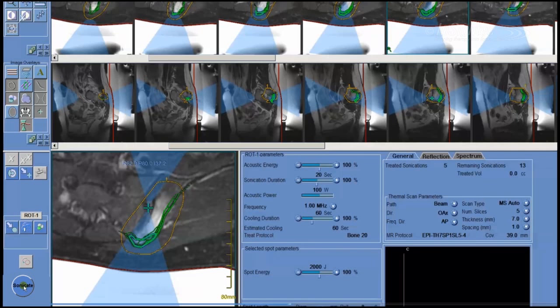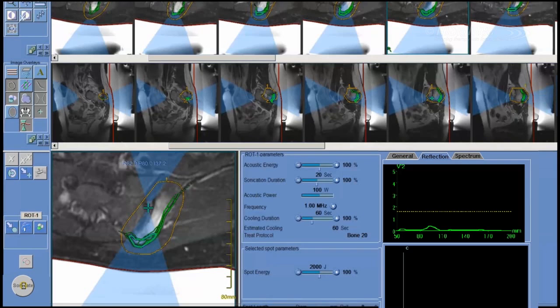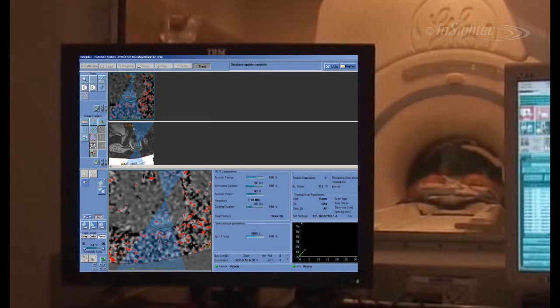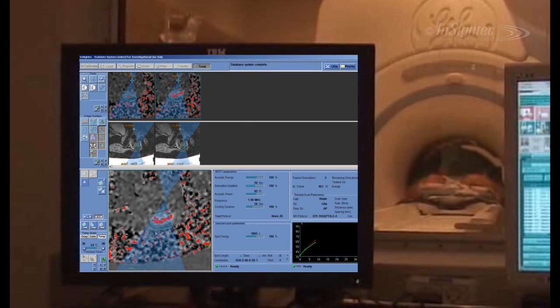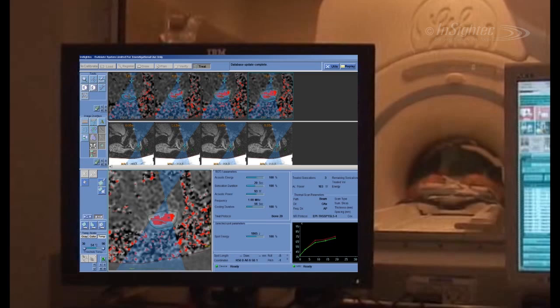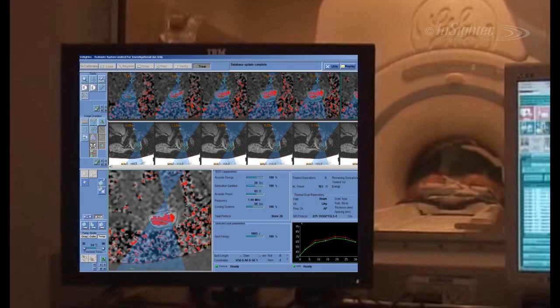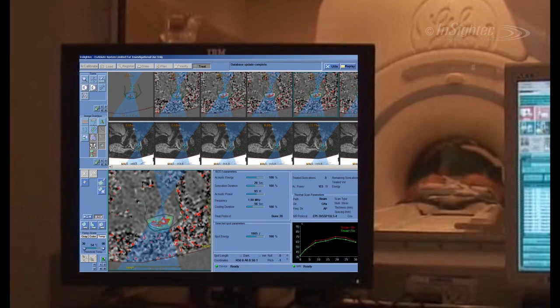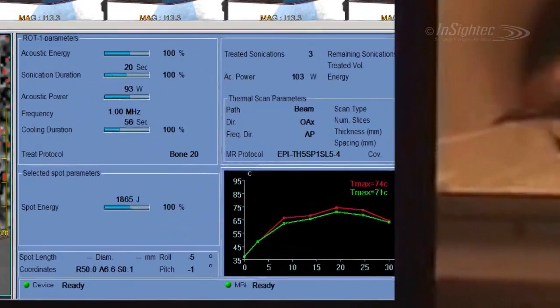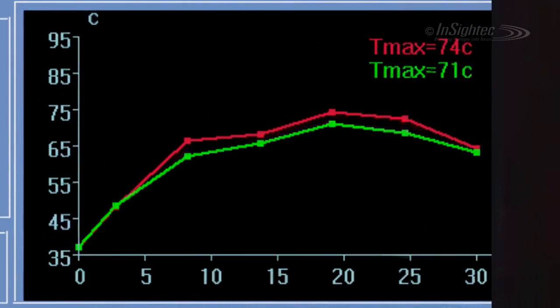Exablate treatment consists of multiple sonications delivered until the entire targeted tissue is ablated. Each sonication lasts about 20 seconds. When the sonicate button is pressed, the MR begins scanning, energy delivery begins, and thermal images are displayed, showing the temperature buildup. The temperature in the bone-soft tissue interface should reach between 65 and 85 degrees Celsius.